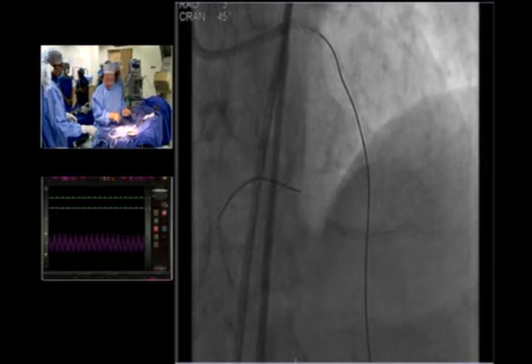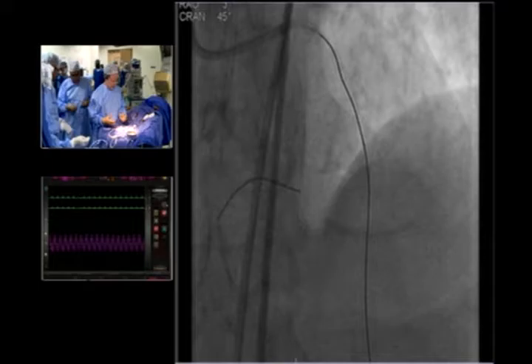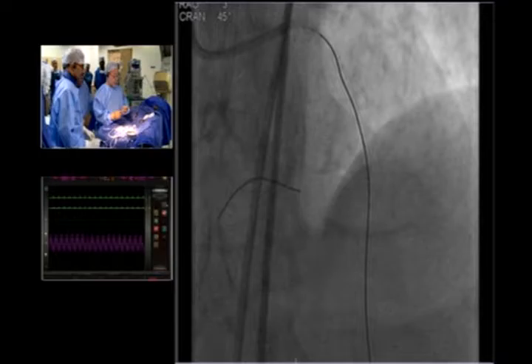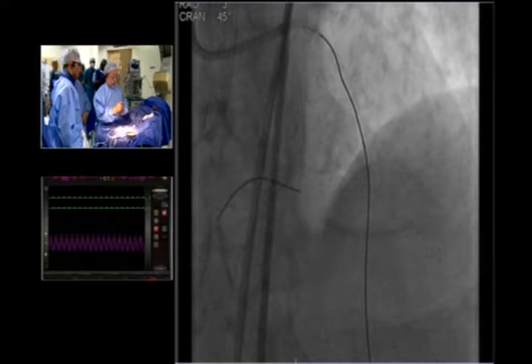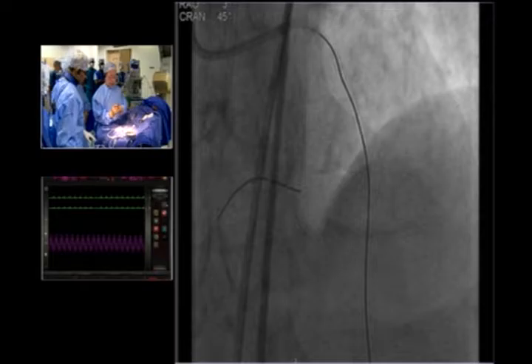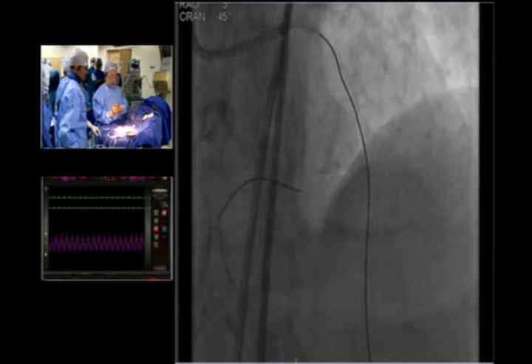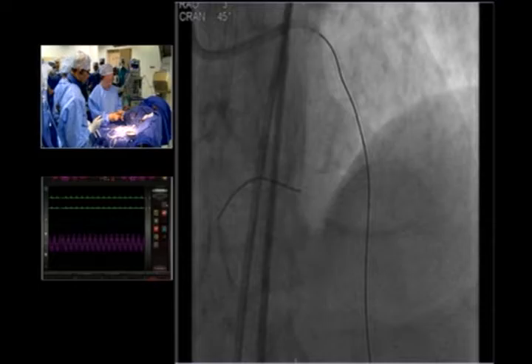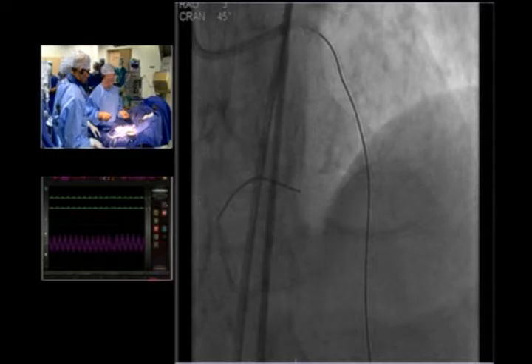The other option is to wire that first septal and put an anchor balloon in that and then be able to pull. Okay. So I'm trying to put this wire parallel to the device. Also give maybe some vasodilators, nitro or some nitroglycerin. Another thought that Dr. Sharma had is to give a vasodilator. Unlikely to help. Nitro. Sister, give some nitro.